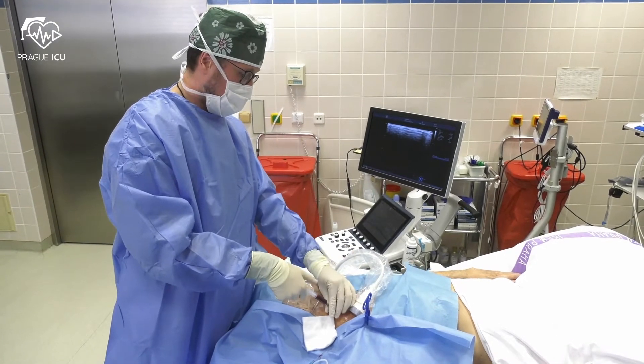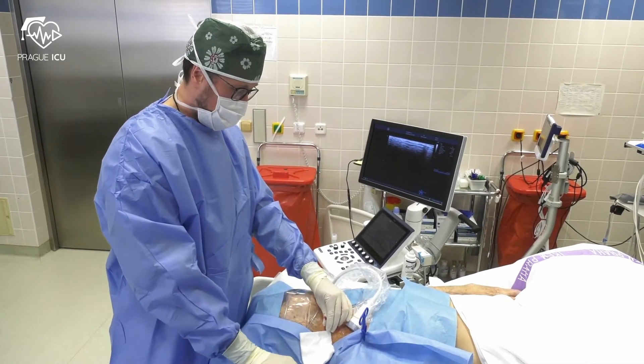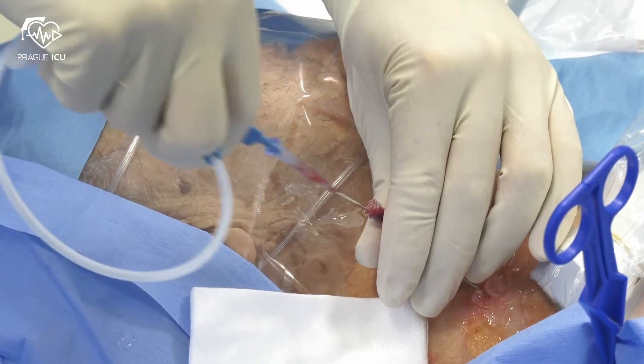Always prevent the puncture of the posterior wall of the jugular vein. When a flush of venous blood is obtained — dark, non-pulsatile flow — advance the wire into the needle.